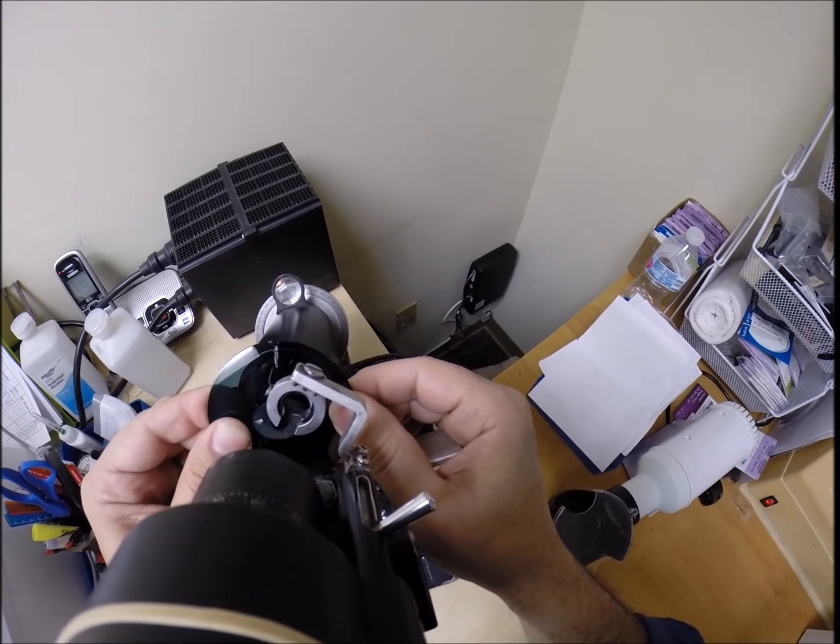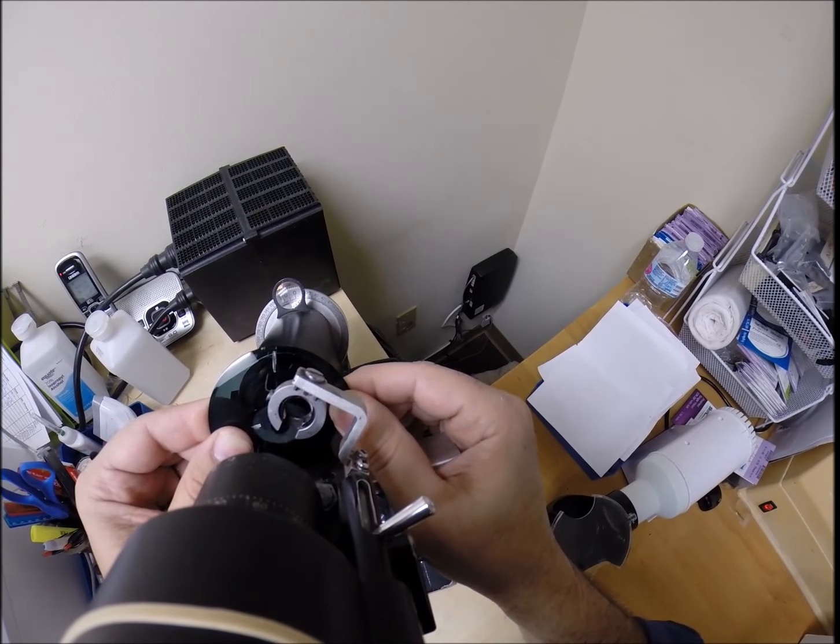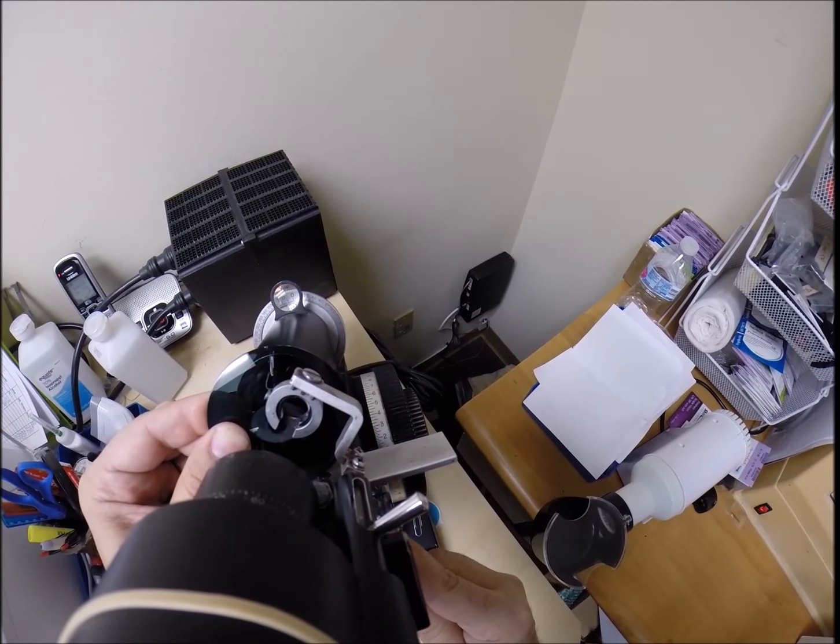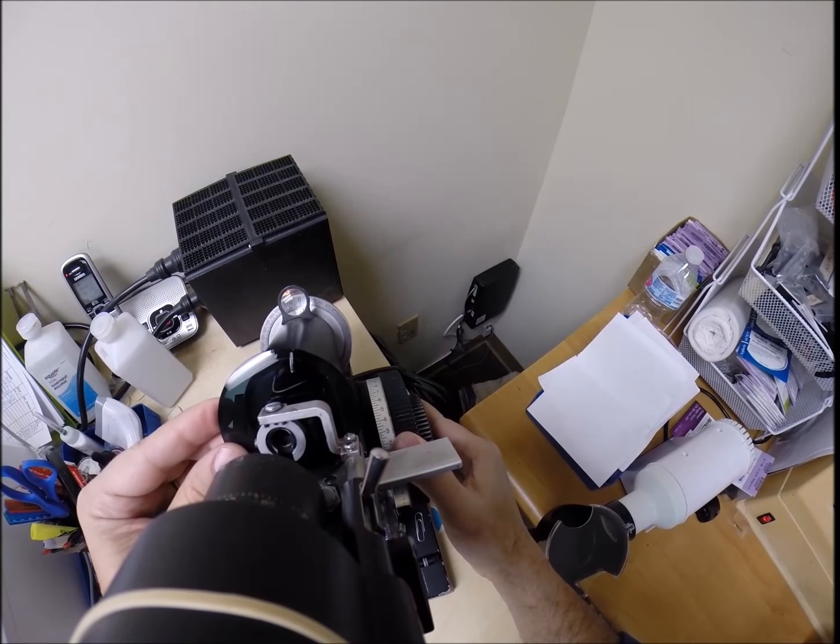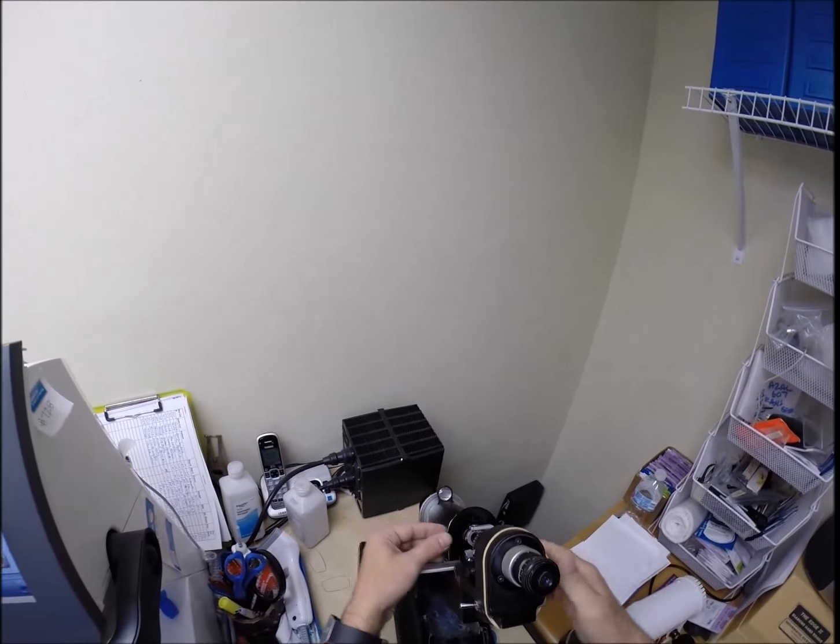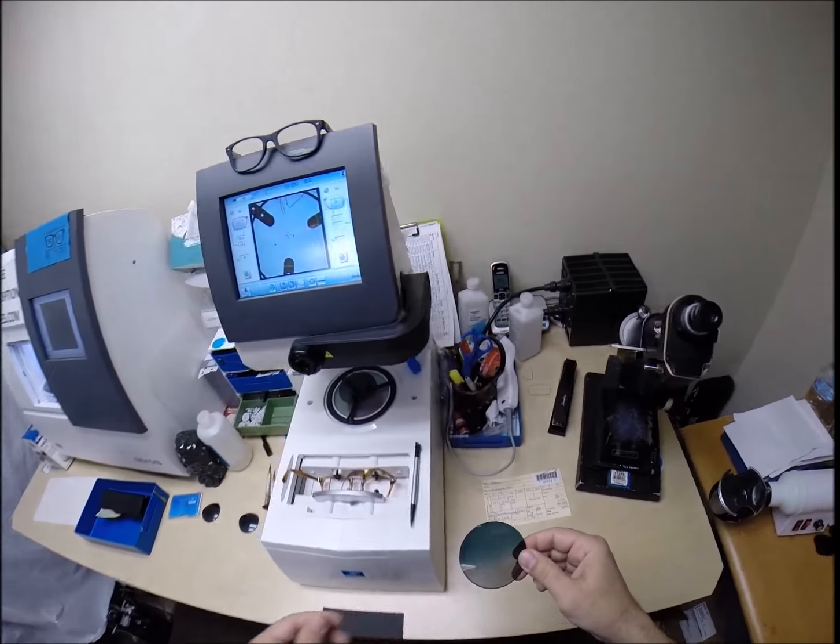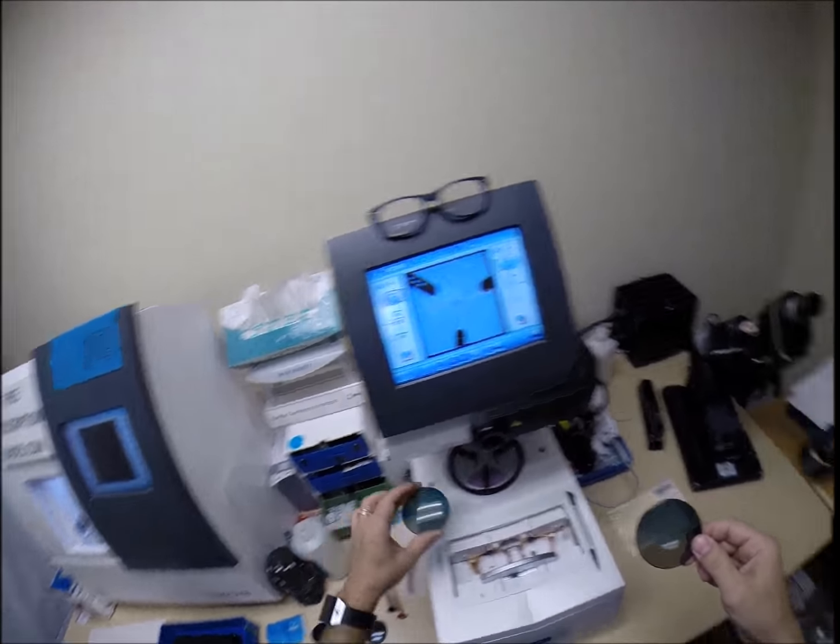Oh, minus one and a quarter. That makes a difference for everything to come in clearly. Tell you, a quarter cylinder is the hardest one to dot up. 150, one and a quarter. He has the smallest amount of astigmatism possible on the left eye. And that's always hard to detect.